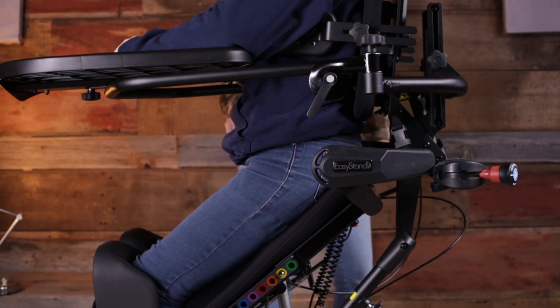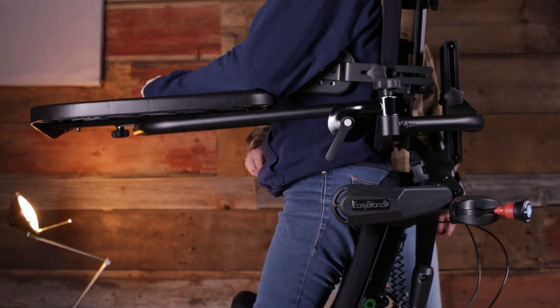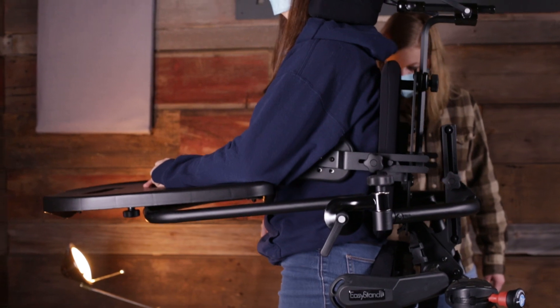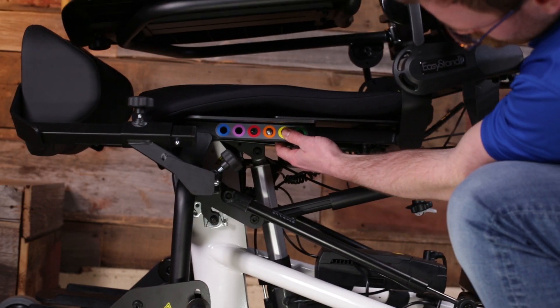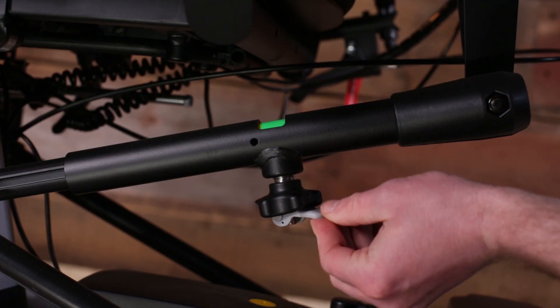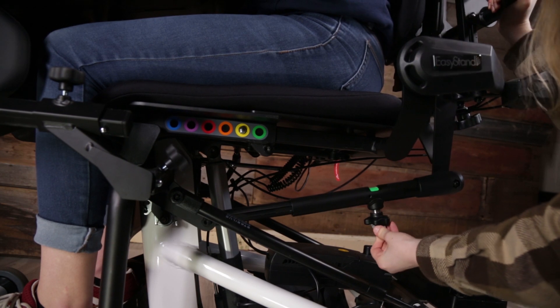EasyStand's exclusive shadow tray provides constant anterior support in any position and features an angle adjustable workspace. Roller bearings make seat depth adjustment easy, and because it is independent of the tray, the back angle can be adjusted while the unit is occupied.